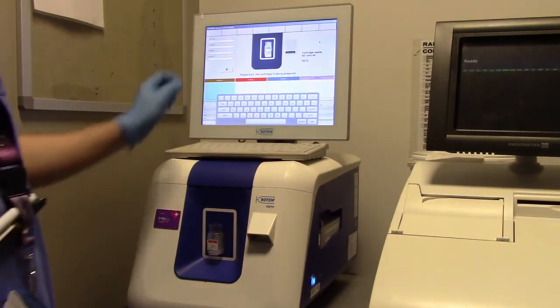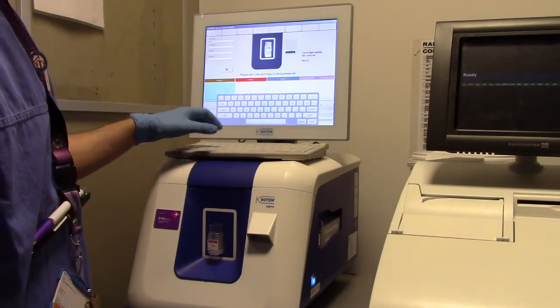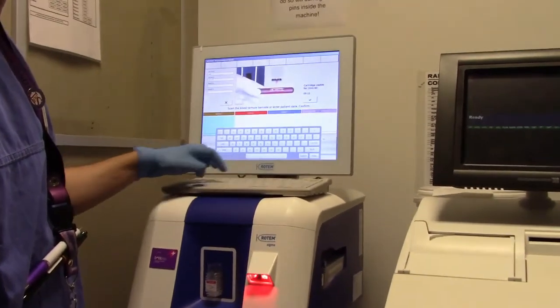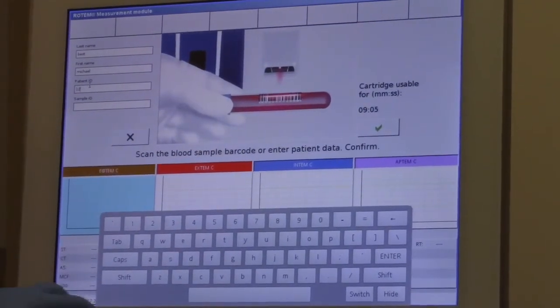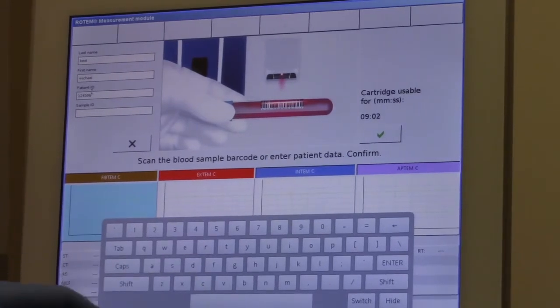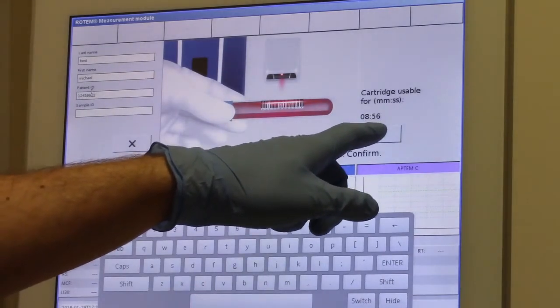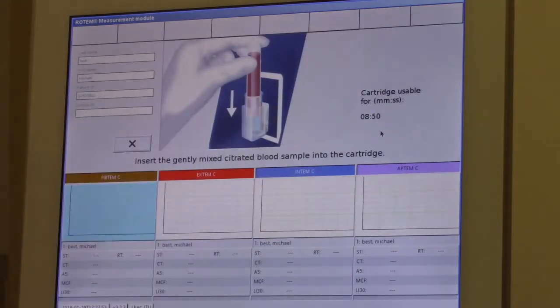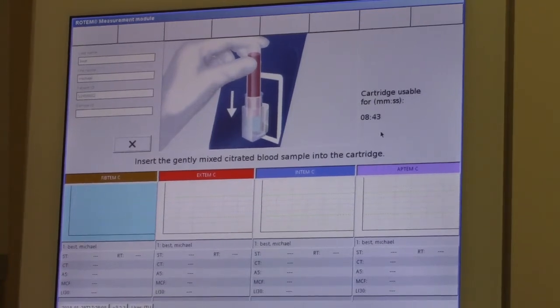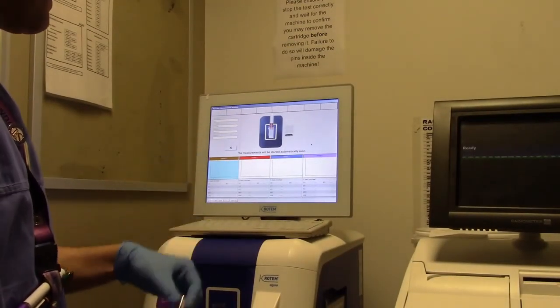Input the patient name and hospital number. Now confirm by pressing the green tick. The measurement will be started automatically.